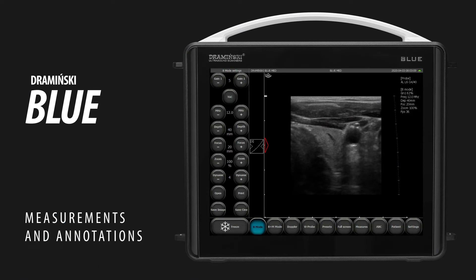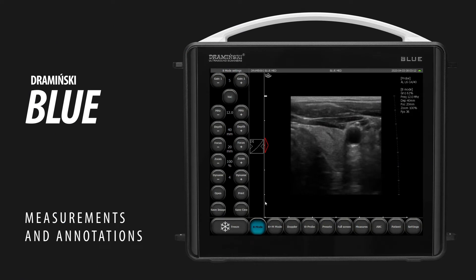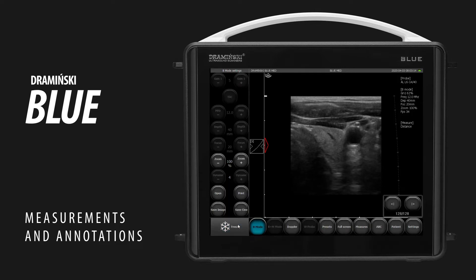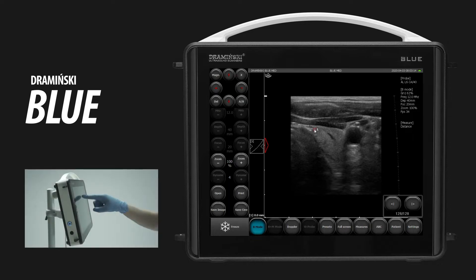To take any measurement, freeze an image first. The distance measurement tool will be activated immediately after you have frozen the image. Put two measuring points by touching two separate fields on the screen.